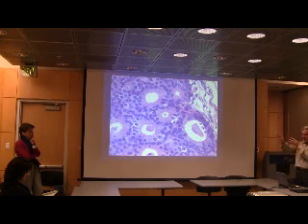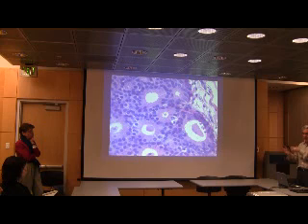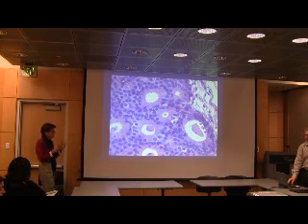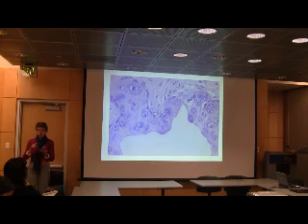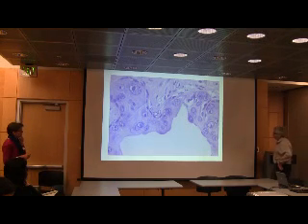Whatever we're seeing that Britt's eyes see, the distinction between DCIS and pre-DCIS is the point at which something becomes neoplastic with genetic changes, clonal versus not. And it's not always straightforward. It's sometimes very difficult to tell. There is a gray zone between the two, so it can be tricky. Next. So here's an example of a very close-up view of high-grade DCIS. The basement membrane is still intact, running along here, and these are very large, very abnormal, very high-grade type cells, still carcinoma in situ. Want to say something about that?